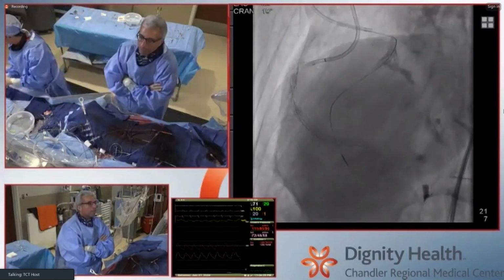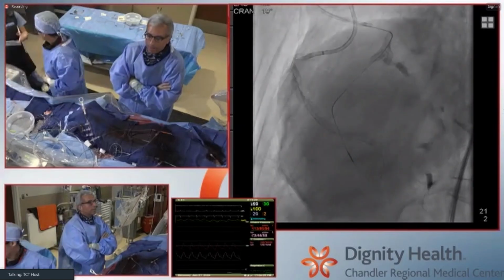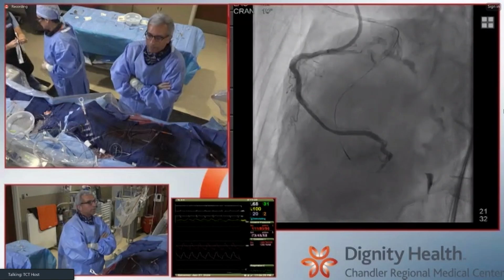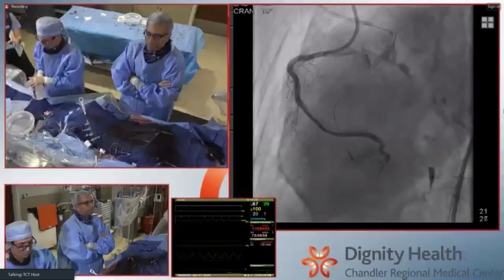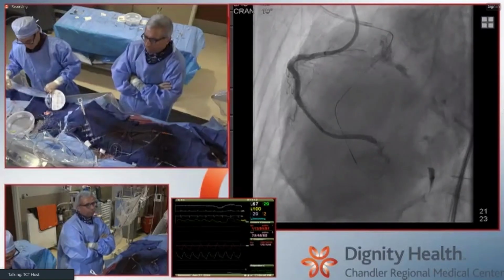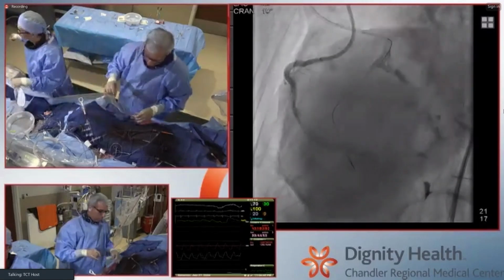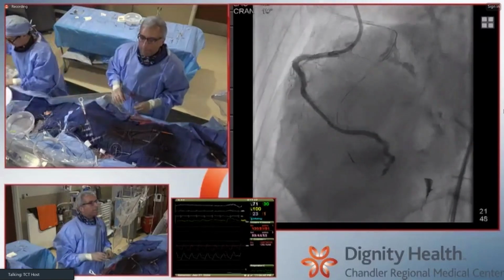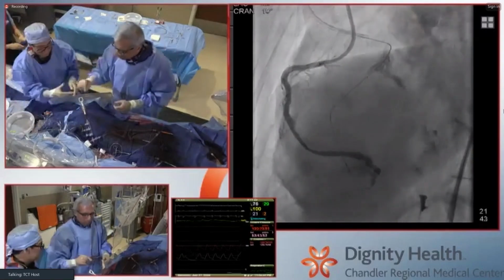And you know, for what it's worth, when I get these sort of things, Ashish, what's your opinion on taking a just gentle 2.5 balloon inflation before you put that stent in to evacuate whatever's in that subintimal space? You've got all kinds of entries into the true lumen, right? You decompress the stuff that's in the subintimal space so that when your stent goes in, you don't have these big collections of stuff that you're stenting over. You get a little bit more security there.